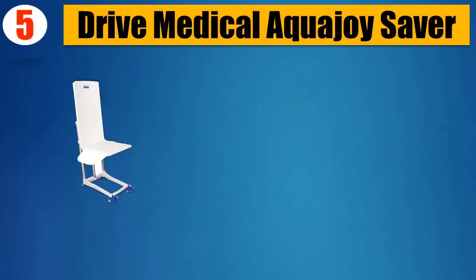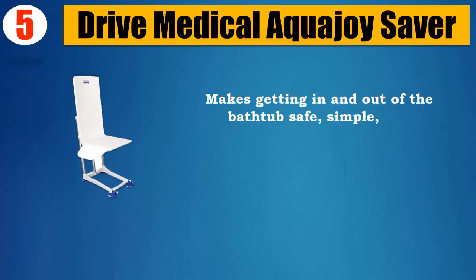Number 5: Drive Medical AquaJoy Saver. Makes getting in and out of the bathtub safe, simple, and worry-free.